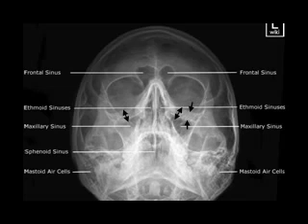Lateral wall of the maxillary antrum. The lateral wall of the maxillary antrum makes a sigmoid curve meeting the alveolar process at an acute angle. If there is erosion of the lateral wall, then this sigmoid curve becomes a straight line.